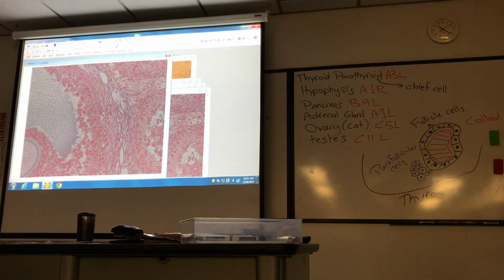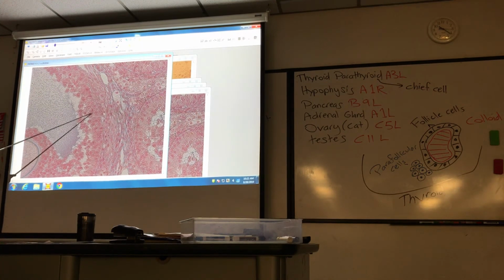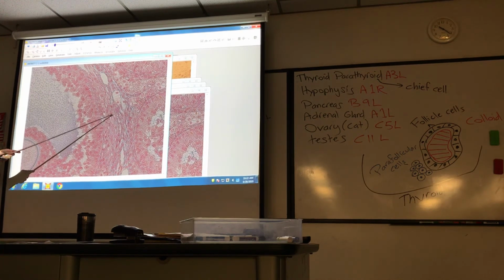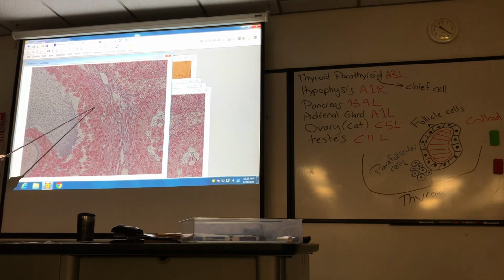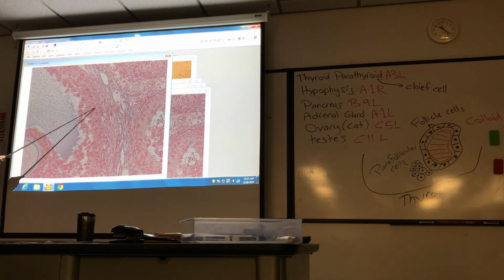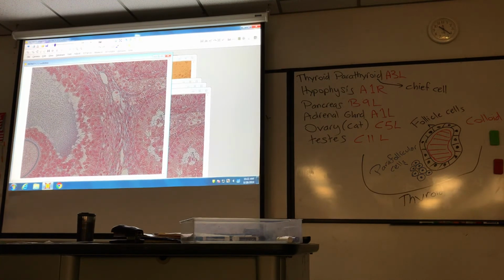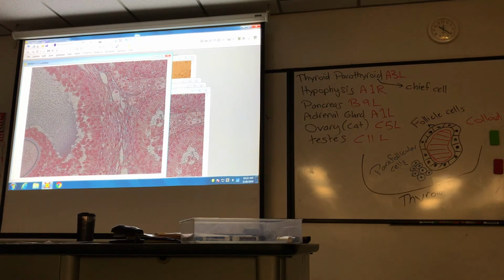All right, so there's the oocyte of a graafian follicle. But I took this picture so you can identify these cells, granulosa cells from here to there. That's theca. These secrete the androstenedione, transferred to here, converted to estrone, under the influence of FSH and aromatase. But anyways, I'll just have you identify things. Theca, granulosa cell, that's it. Moving on. Any questions on ovary? You got one to go.